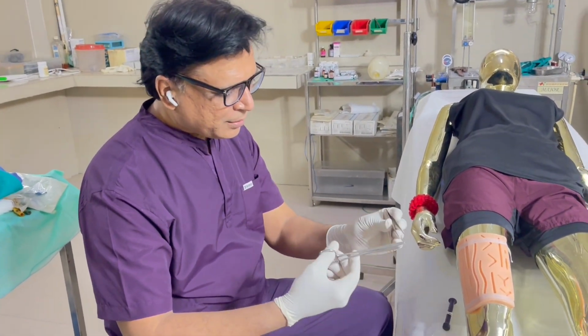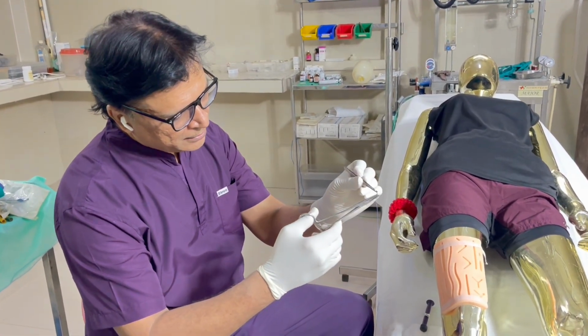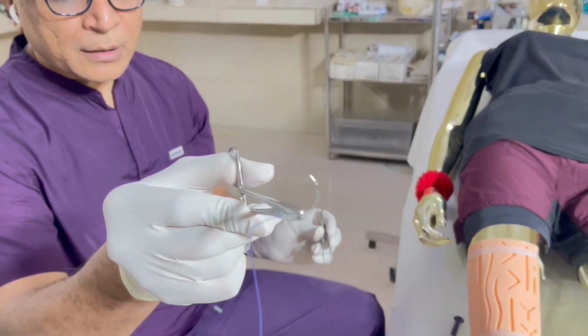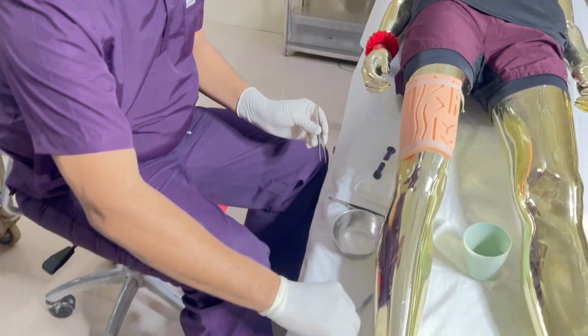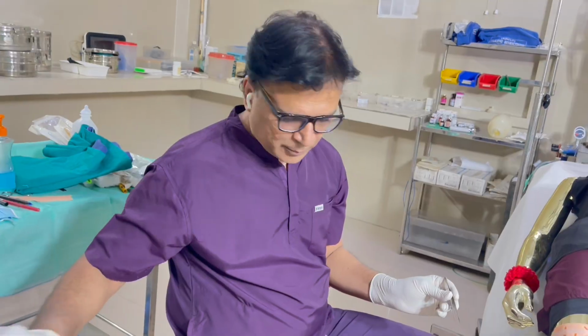I already put it on the needle driver. How to hold this suture on the needle driver, it should be in this manner. So needle driver, suture, tooth forceps, and the suture cutting scissors.